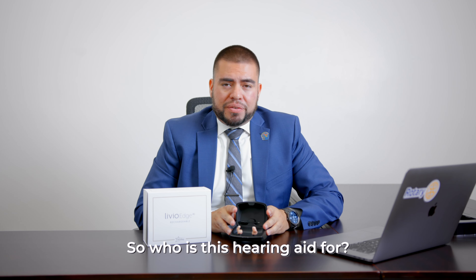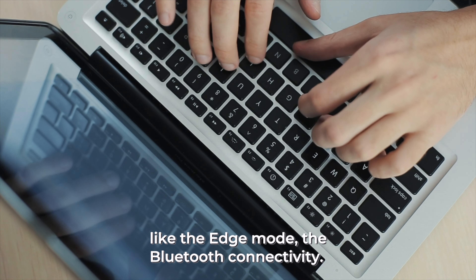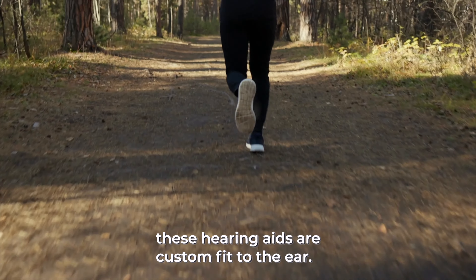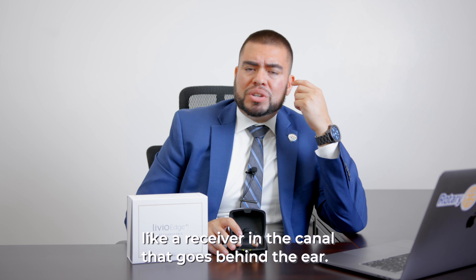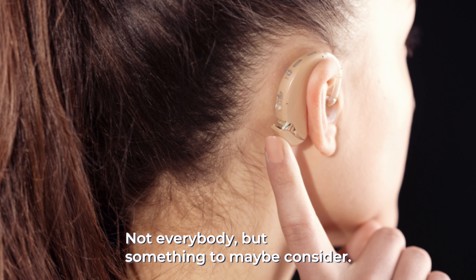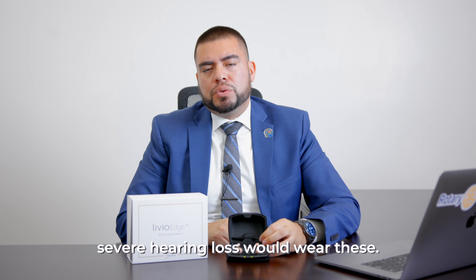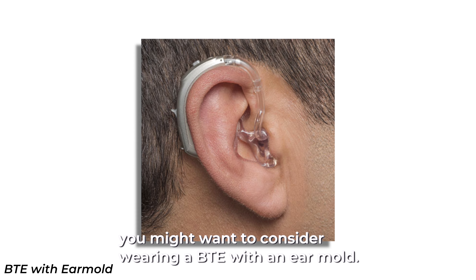So who is this hearing aid for? I would say someone who's tech savvy, so they can benefit from all the features like the Edge Mode, the Bluetooth connectivity, the rechargeability and all that stuff. Also someone who's an active person, because these hearing aids are custom fit to the ear, so they will be nicely fitted and they won't be moving around like a receiver in the canal that goes behind the ear. Someone who has a mild to maybe borderline severe hearing loss would wear these, because once you start getting into the severe profounds, you might want to consider wearing a BTE with an ear mold.